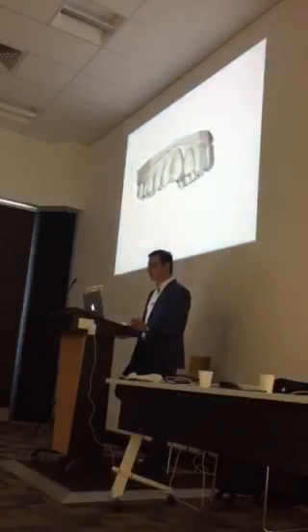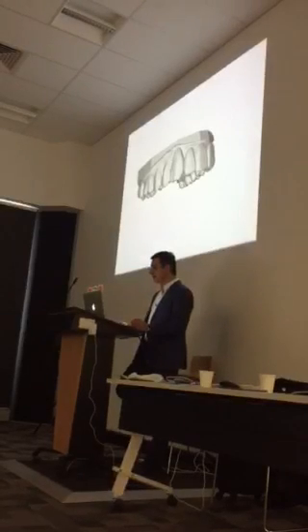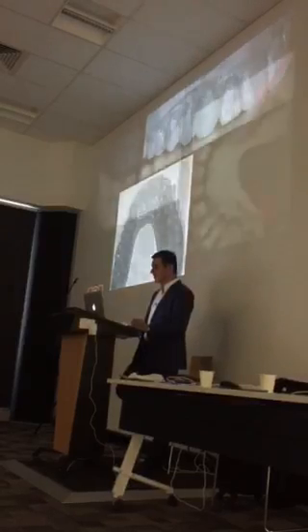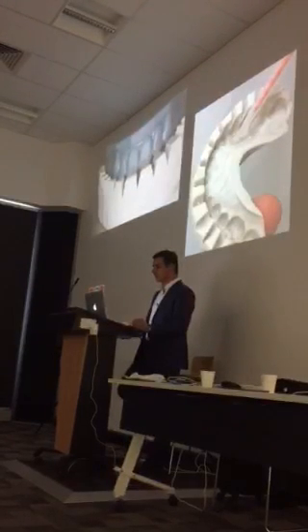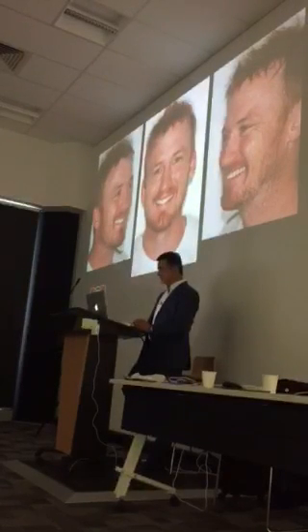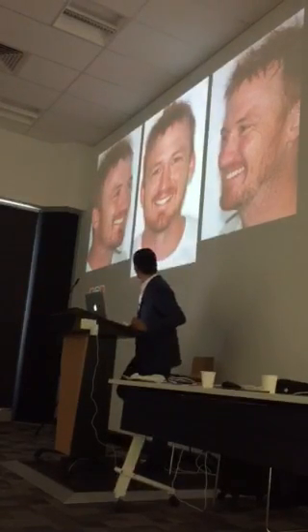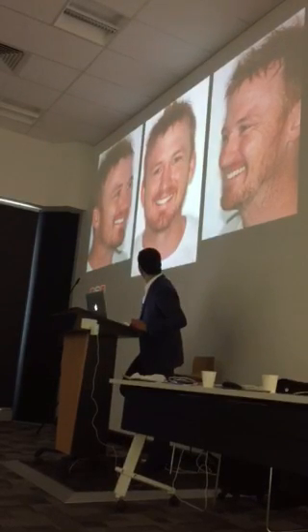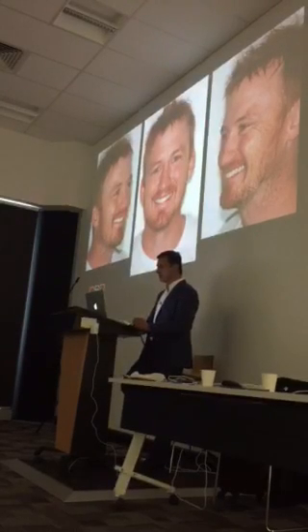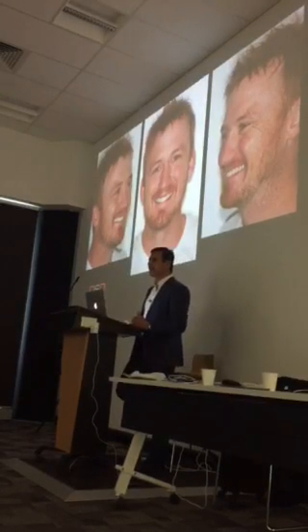Again, we get the 3D model back as an STL, we check, we print, we mock up, very easy, still prefer the silica, and that's a straight out mock up. I use this slightly, an A1, A2, but you can see, in terms of the ideal proportions for this patient, you get an indicator.